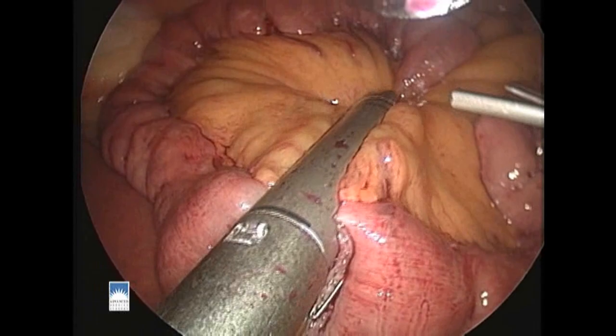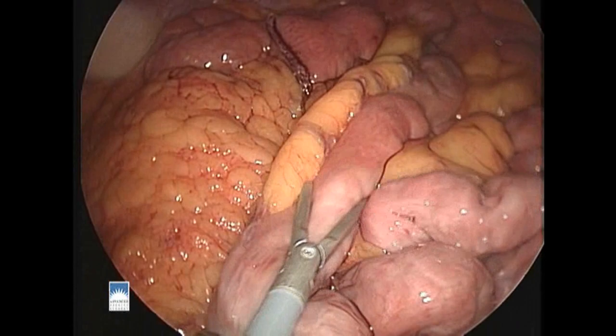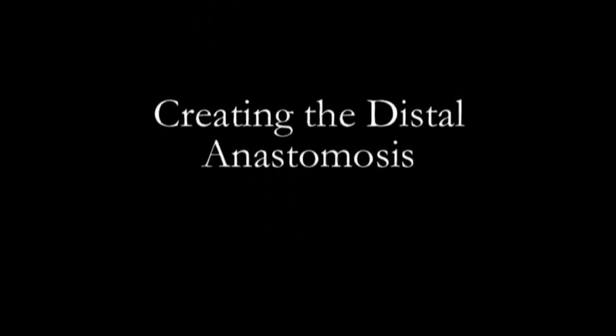We then fire one more firing of the stapler onto the mesentery of the bowel for increased mobility. We then measure down 100 centimeters from the point of division, and this will become our spot for our new anastomosis.